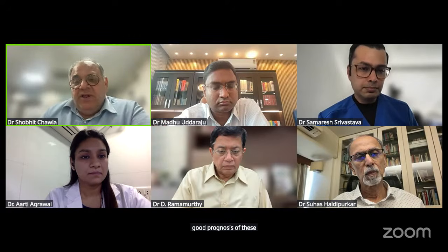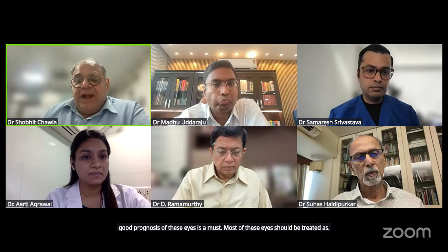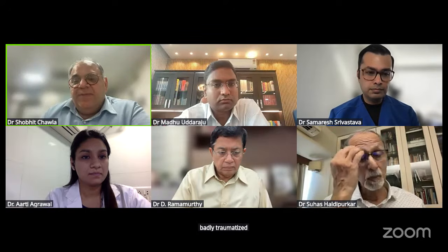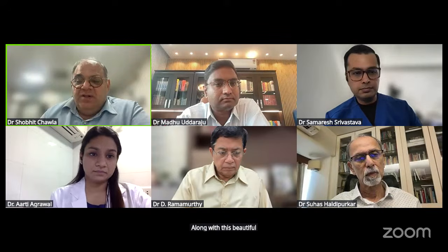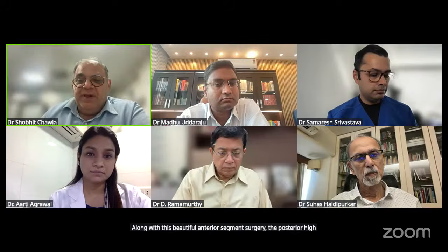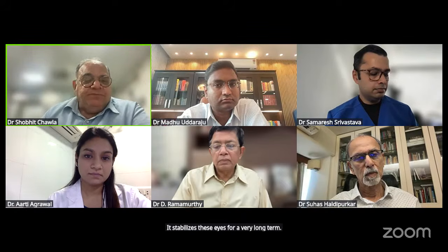Most of these eyes should be treated as badly traumatized eyes, and if you are able to get out the posterior hyaloid along with this beautiful anterior segment surgery at the same time, it stabilizes these eyes for a very long term. Thank you.